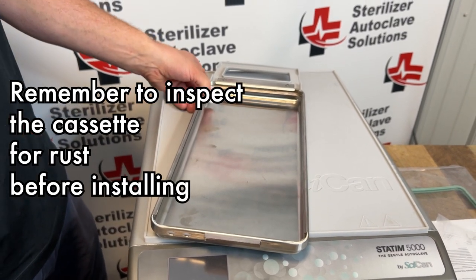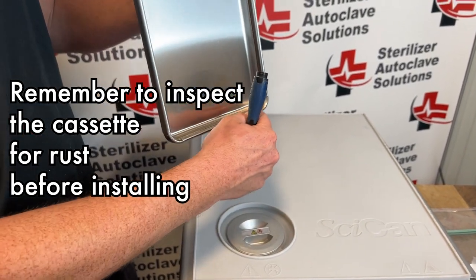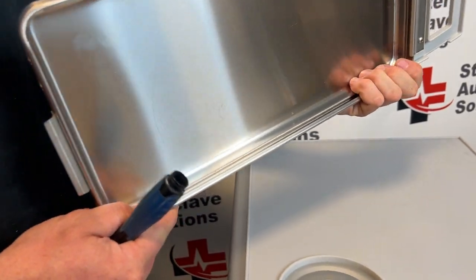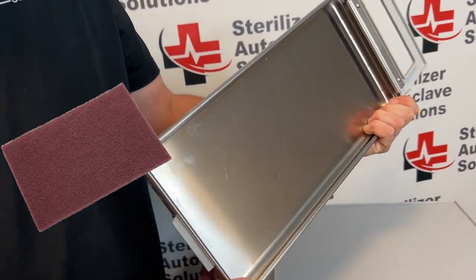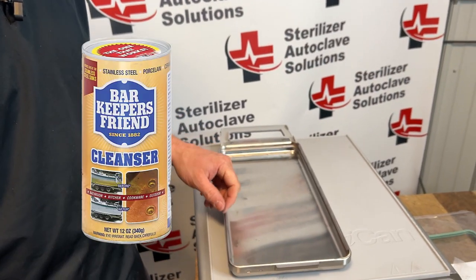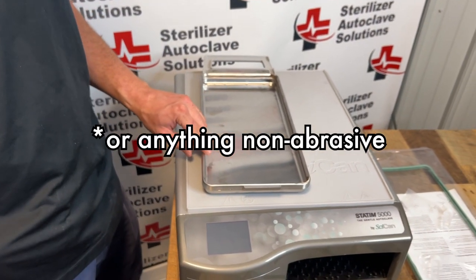You do want to inspect and make sure that you do not have rust buildup or anything that could cause issues on the inside. If you do, you can use Scotch-Brite and Bar Keepers Friend or anything non-abrasive to help clean that.